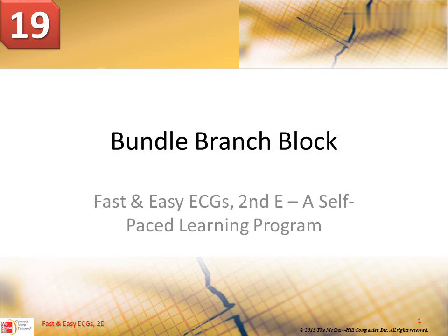19. Bundle branch block. Fast and Easy ECGs, Second Edition, a self-paced learning program.